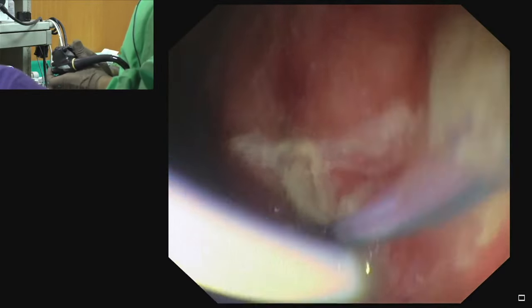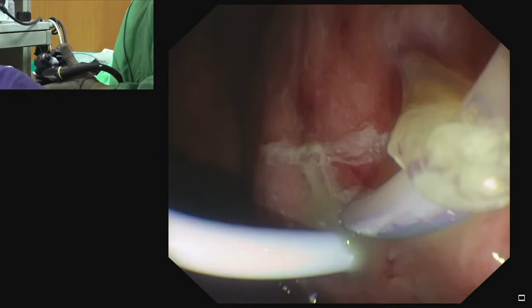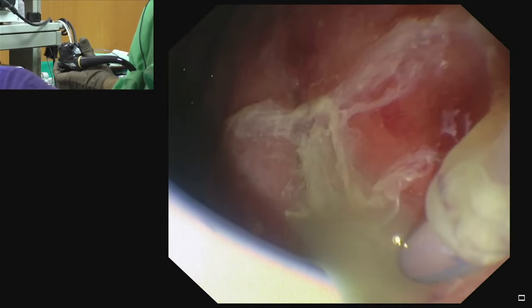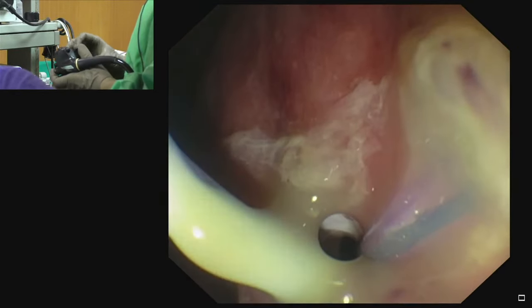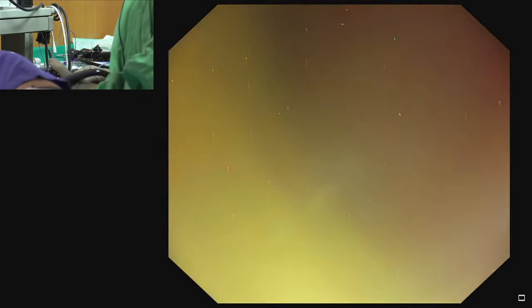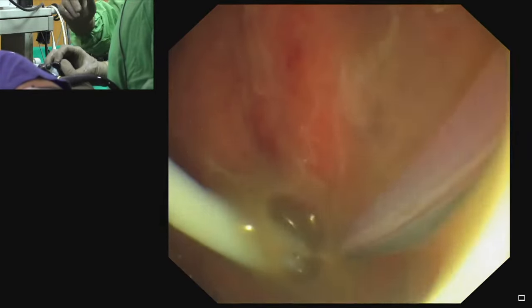We again make multiple loops of guidewire, confirming it is inside the walled-off collection. After formation of multiple loops, we exchange the cannula — gently removing the cannula — and place another plastic stent. In this patient we are placing a 10 French, 7 cm double-pigtail stent. If the cyst is small, a 10 French 5 cm stent can also be used, but this is a large cyst so we use the 10 French 7 cm double-pigtail stent.